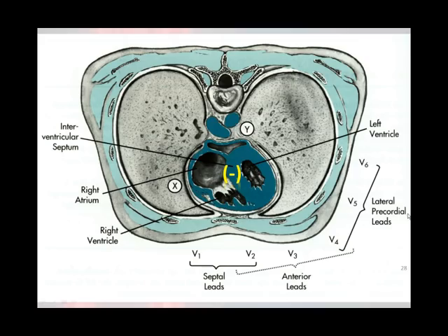Now let's go ahead and look at where the precordial lead placement is supposed to be. I want you to look at these leads and take a look at the heart here. The heart is in the middle, and right in the middle you have the central terminal, which is the big negative right there in the parentheses. That's the central terminal. Now, the precordial leads are the unipolar leads that are looking from the surface of the body all the way into the middle of the heart. So if you place these electrodes in the proper spot, these are the general areas where you're going to look.